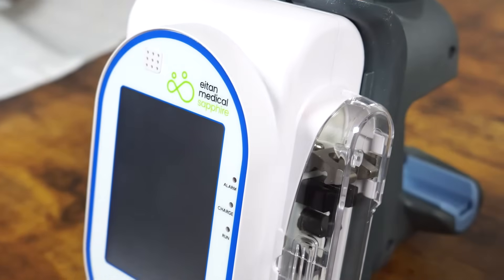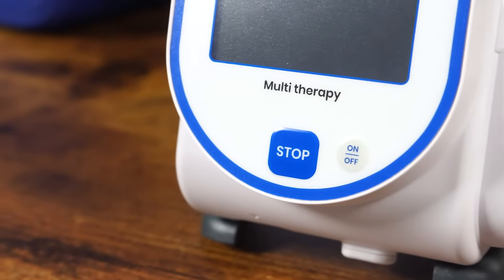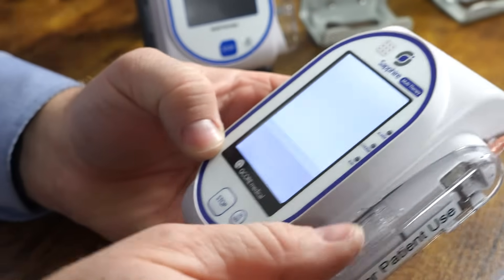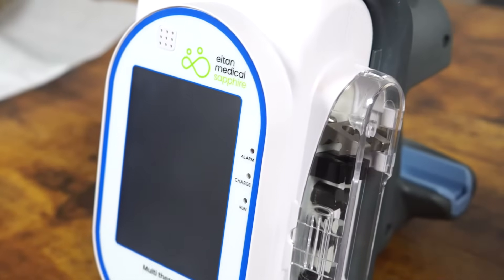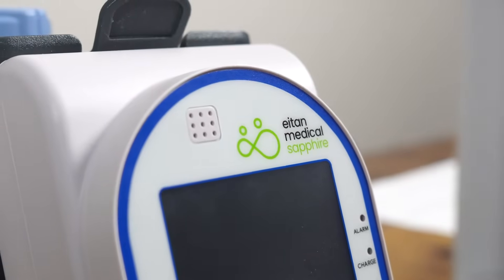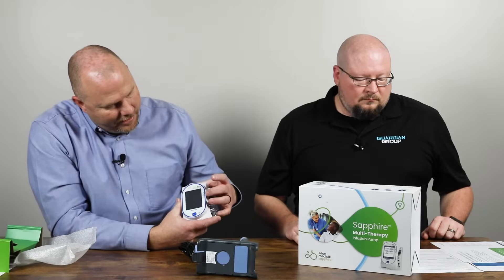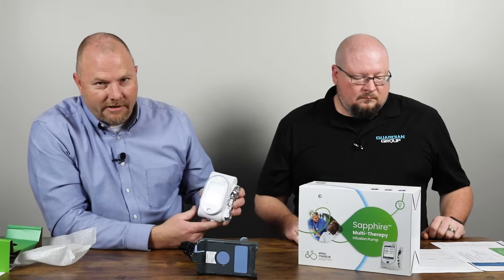The pump itself on the face has only two buttons: a stop button which stops an infusion immediately, and the on-off button which powers the device on and off. There are three indicator lights. The top light is an alarm — anytime there's an alarm during an infusion, you will hear an audible alarm from the speaker and this light will flash red. The next light is a charge indicator. And the bottom light is a run indicator — it will flash green during an infusion.